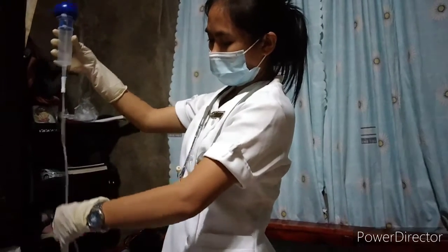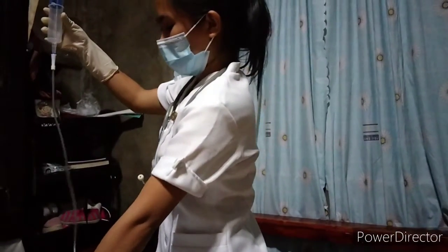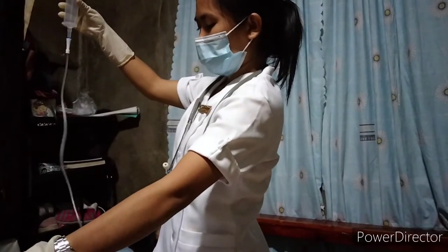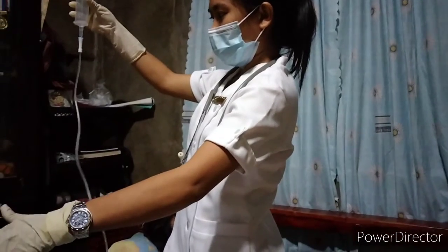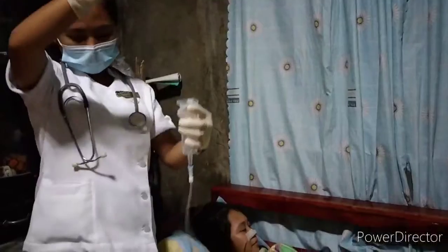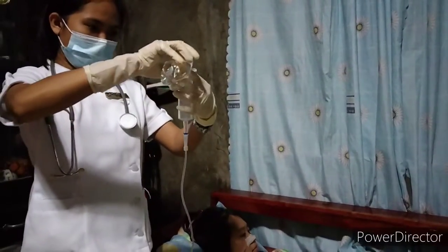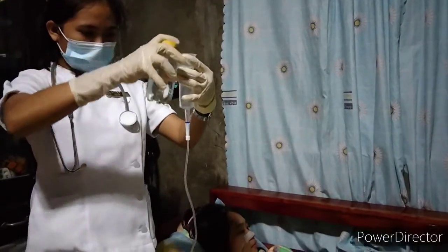Initiate feeding. Bolus or intermittent feeding: pinch proximal end of the feeding tube. Remove plunger from syringe and attach barrel of syringe to the end of the tube. This prevents air from entering the client's stomach. Fill syringe with measured amount of formula, release tube, and hold syringe high enough to allow it to empty gradually by gravity. Refill and repeat until the prescribed amount has been delivered to the client.